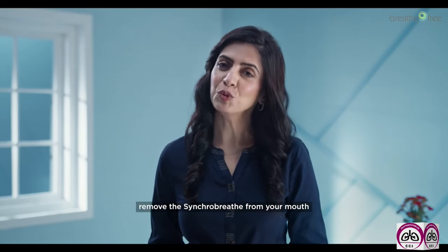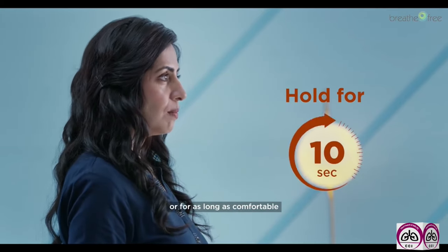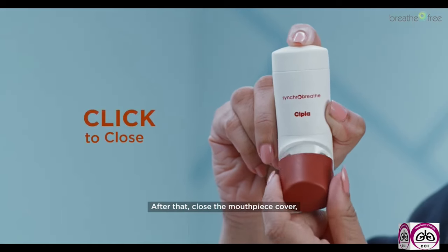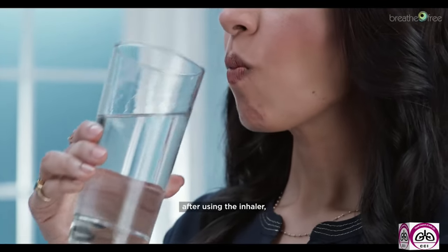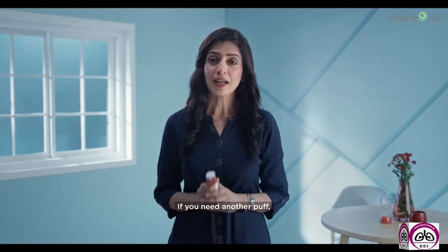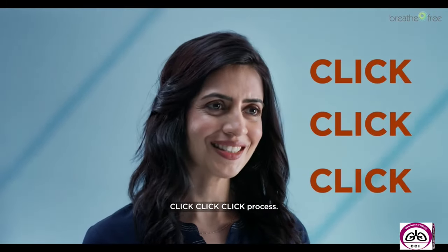When you're done, remove the SynchroBreathe from your mouth. And hold your breath for 10 seconds or as long as comfortable, and then breathe out slowly through your nose. After that, close the mouthpiece cover. And that's the final third click. Always remember, after using the inhaler, rinse your mouth with water and make sure you don't swallow it. If you need another puff, follow the same click, click, click process.